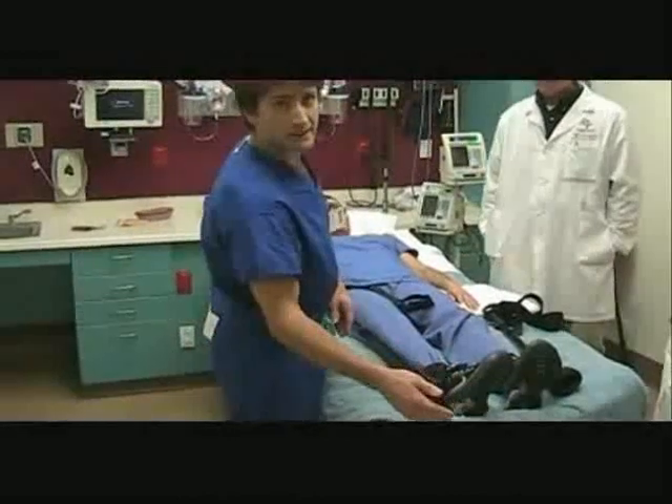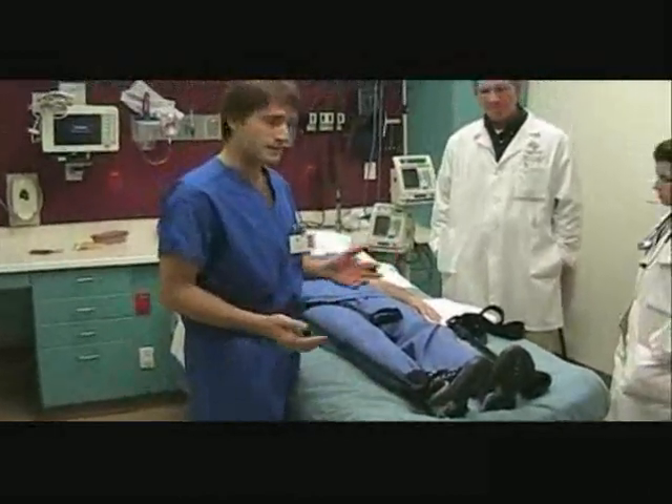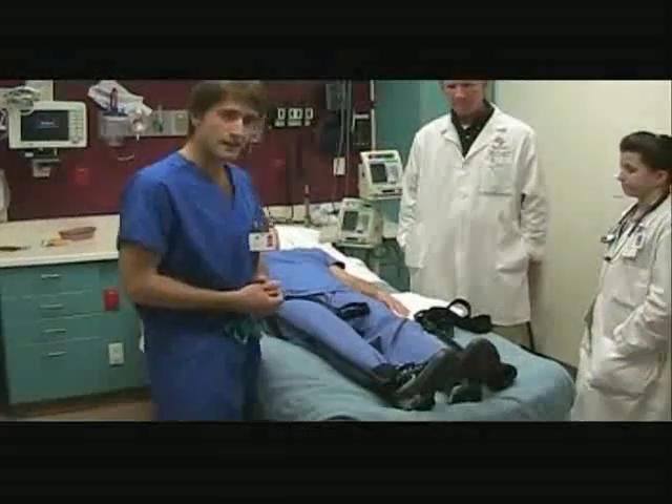There's no overhang beyond the leg, so that makes it easier to fit into helicopters, baskets, small ambulances and the like.